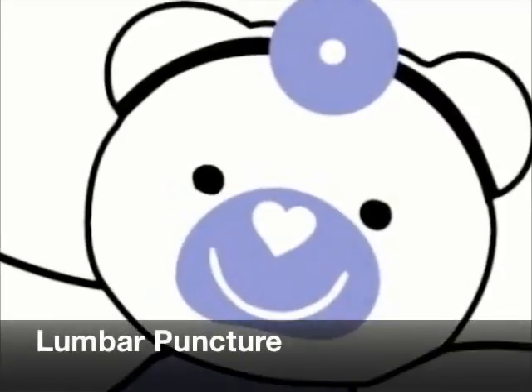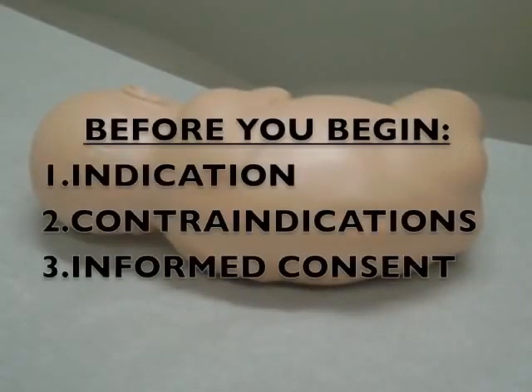This video will introduce you to lumbar puncture, an important clinical skill in pediatric medicine. The most common indication for lumbar puncture in pediatrics is to look for a CNS infection such as meningitis or encephalitis. You must also ensure that there are no contraindications.